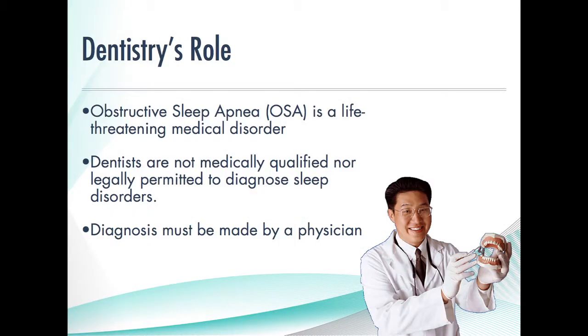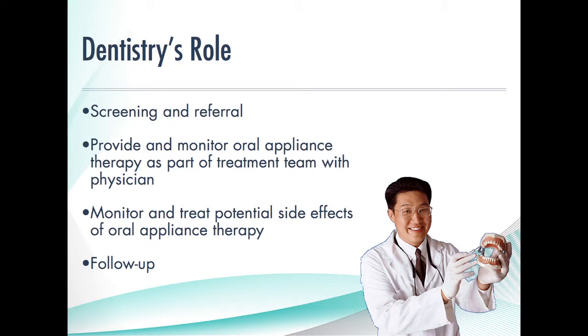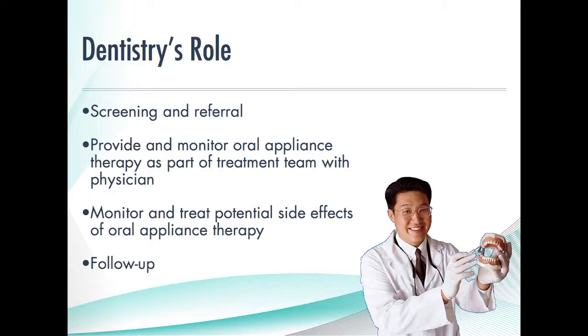So we're really good, but we don't diagnose. We encourage diagnosis, and that's our job. So we screen. We provide the oral appliances for people who fail CPAP, which is our most common population that comes to see me, that and primary snorers. But most primary snorers, I kick them back to their MD for not just financial reasons. Say, I don't care, I'll just write the check. But most of them fit the profile, and I want to get a PSG on them to make sure that I'm not missing something and I'm not doing something bad.